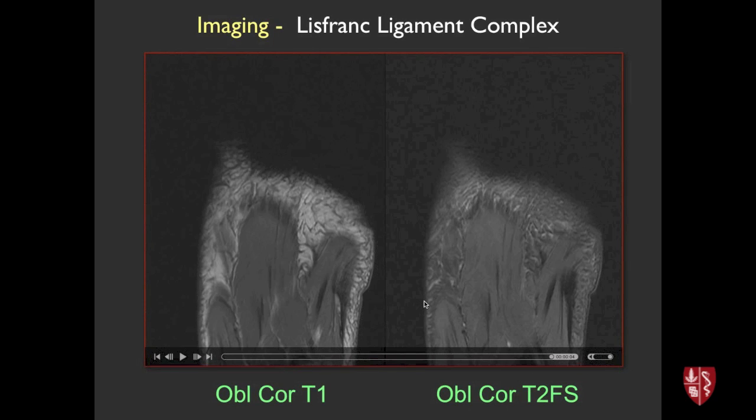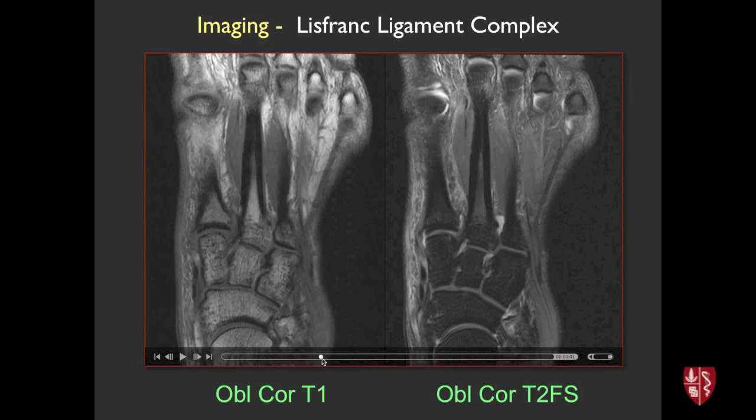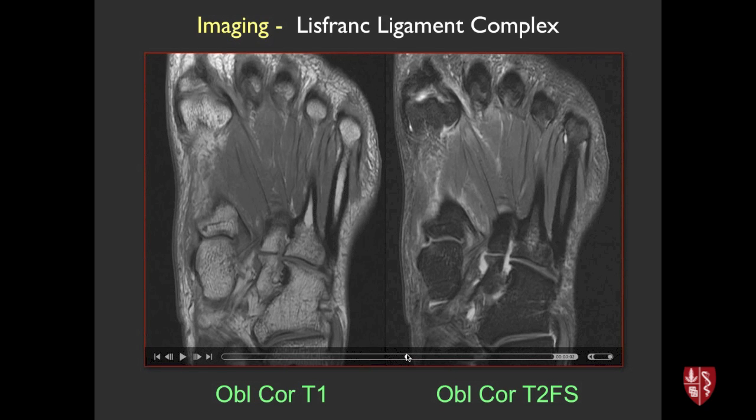Looking at the same athlete with T1 placed next to T2 fat suppressed images helps get oriented to the anatomy. We use T1-weighted images to look at bony anatomy and get oriented. Here's the medial cuneiform and second metatarsal base - that's the interosseous Lisfranc ligament. Going a little more plantar, we try to find the plantar C1-M2 ligament without being confused by the other tendons passing by.